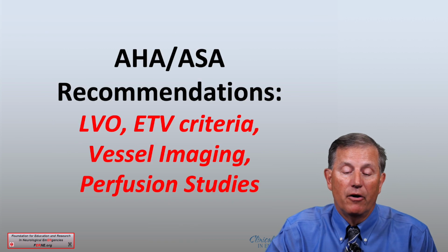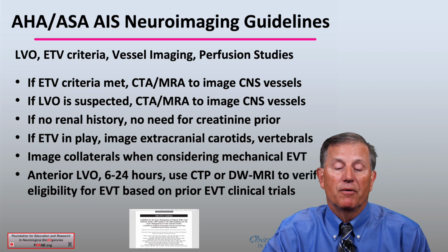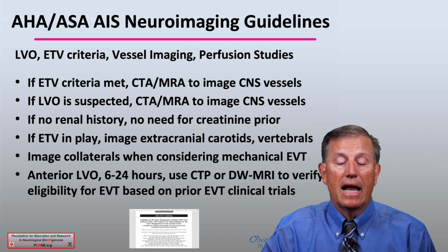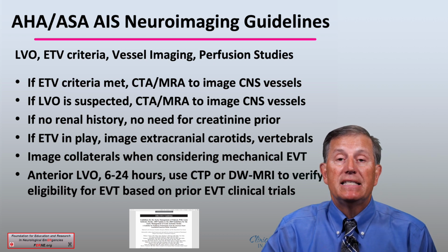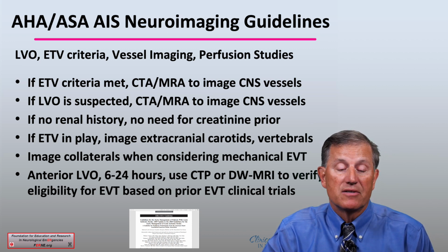What about these other areas? LVO, EVT criteria, vessel imaging, and perfusion studies. The guidelines say if the EVT criteria are met, then you can use CTA or MRA to image the CNS vessels. Or if an LVO is suspected, you can do the same.